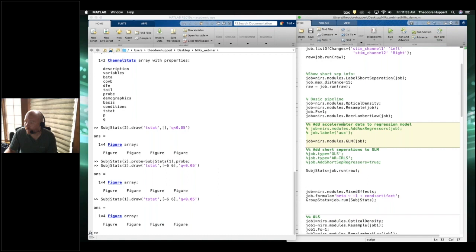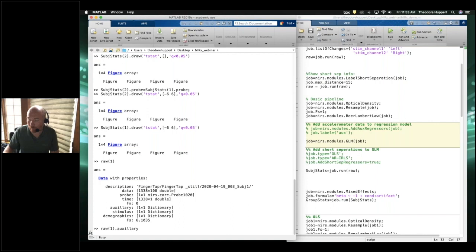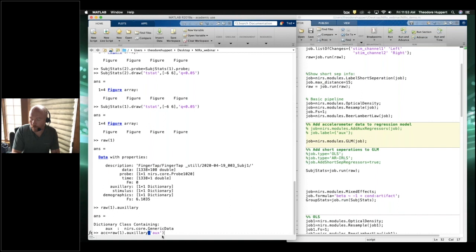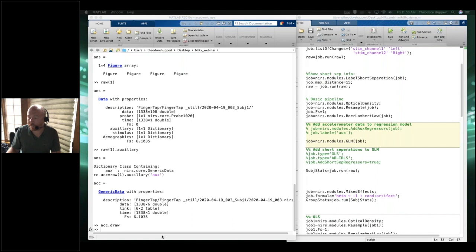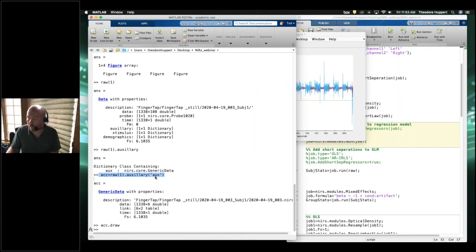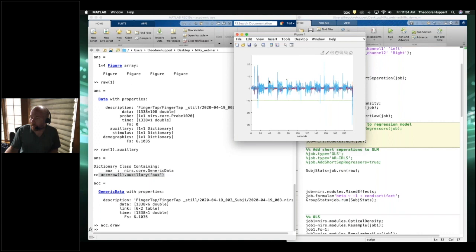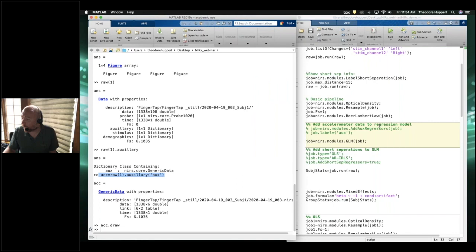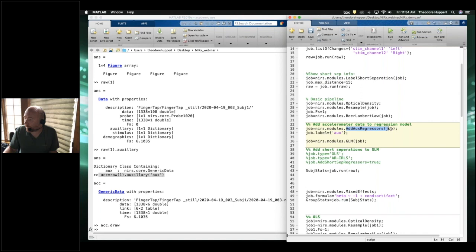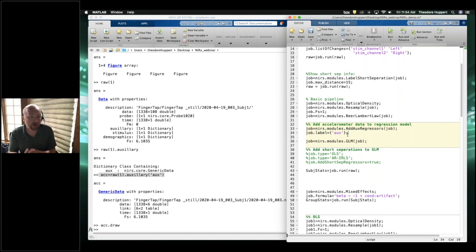We also have accelerometers recorded in this data, stored in the auxiliary field. We can extract and draw the auxiliary data — when they were tapping their fingers there's a visible effect, their head is moving more. We can run code called add_auxiliary_regressors, which takes those accelerometer channels from the external recording and puts them in as regressors of no interest within the GLM.